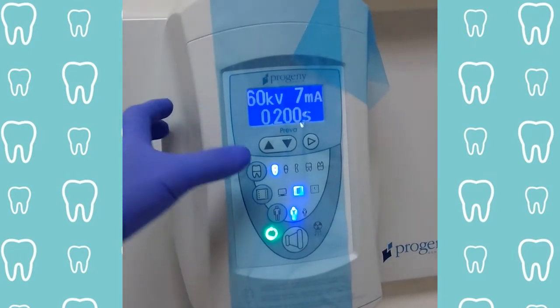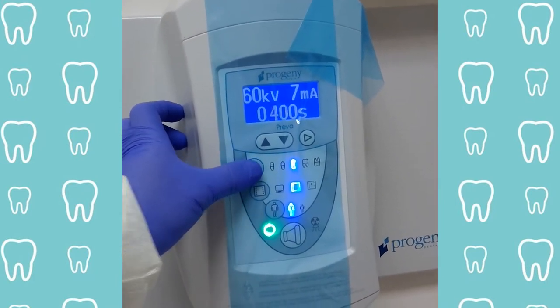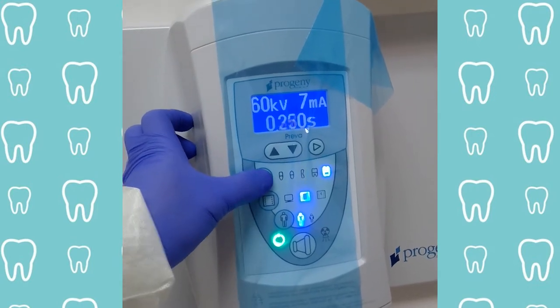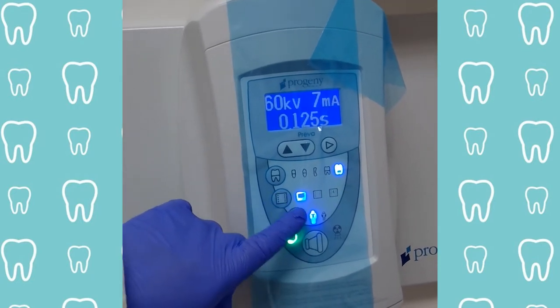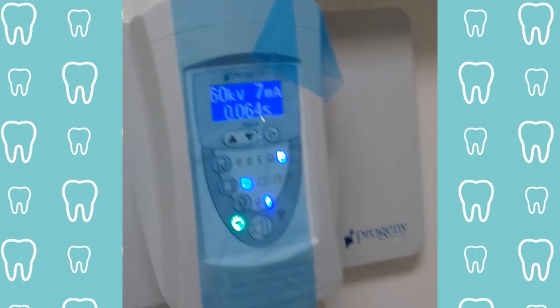For comfort and stabilization, adjust the headrest to meet the patient's head to stabilize them for x-rays so they don't strain themselves. Adjust the control panel: the first setting will be centrals, then canines, then bite wing x-rays, lower posterior teeth, and then upper posterior teeth. The middle setting will be for our digital, our films, or our phosphor plates. The last setting will be for adults or a child. Set correctly.